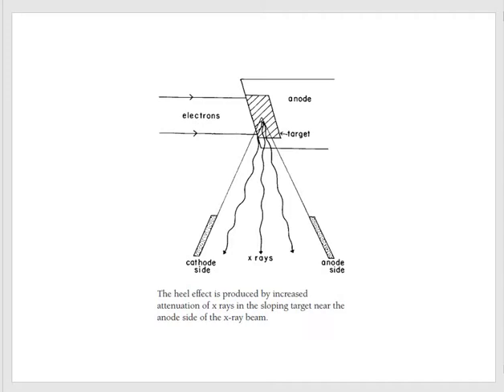The 1% that impinge on the anode and produce X-rays will be hitting the anode target at various depths. Those produced near the surface have a shorter distance to travel to reach the exit window. Those produced deeper in the anode target need to overcome a longer travel path before they can reach the exit window.